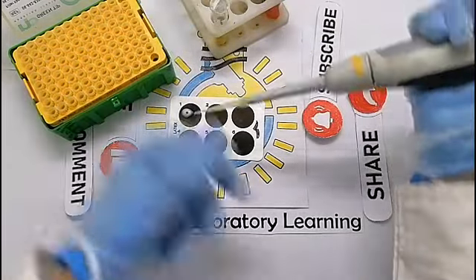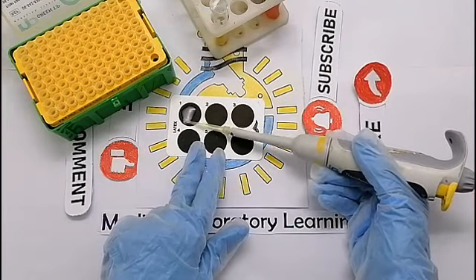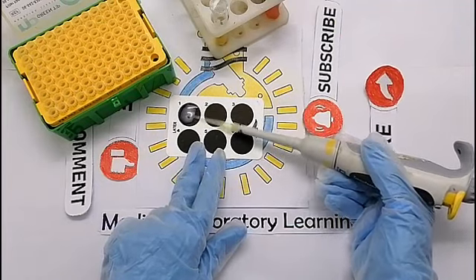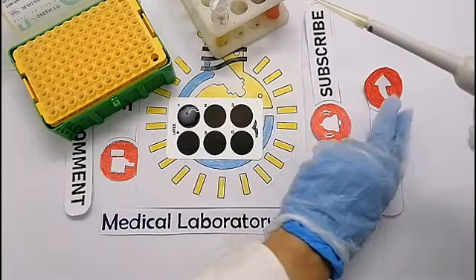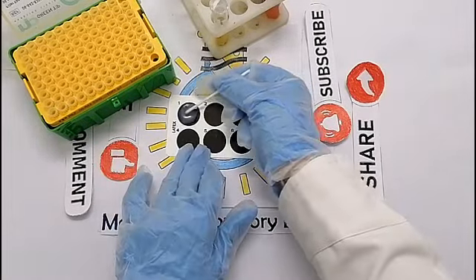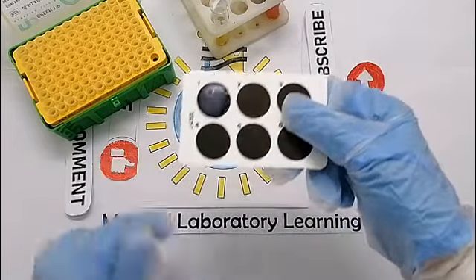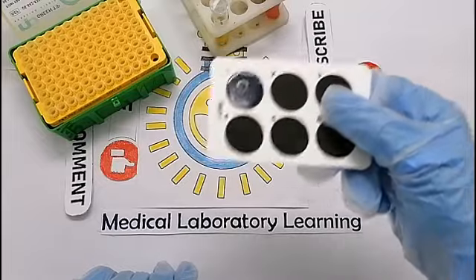We mix them with an applicator completely until the entire black circle is covered. Then we place it on a shaker for 1 minute to mix them completely.